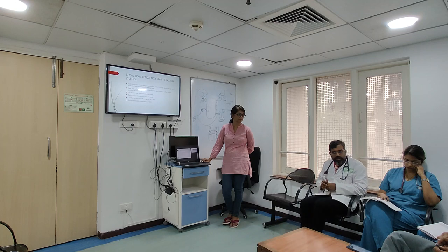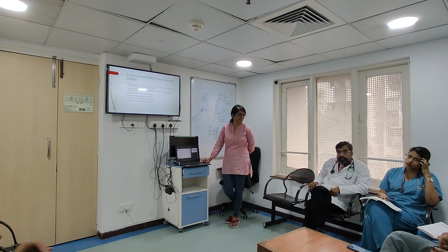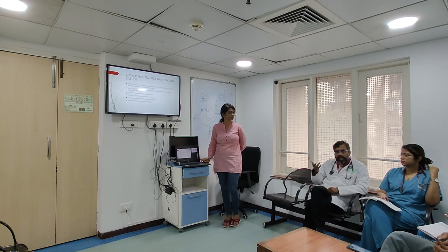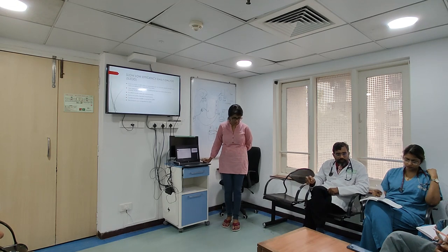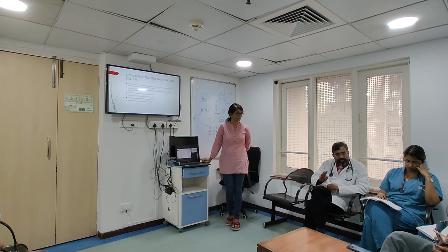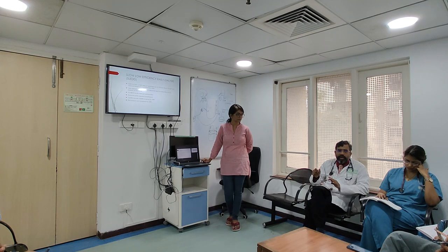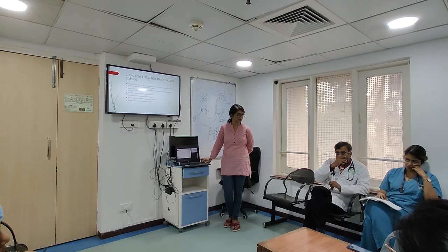So we don't use a dialysate in this, and we'll just start. I will not have the RO plant attached. I will not have the RO plant from where my replacement dialysate fluid is coming. I'm not going to use that. All I'm going to use is the filter and the patient's blood. That's all. Patient's blood, filter, and I will keep my ultrafiltrate because I'm increasing my hydrostatic pressure across the membrane to give me the fluid that is going to come out.